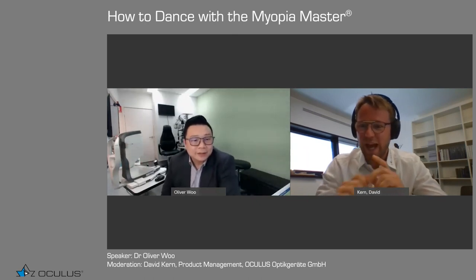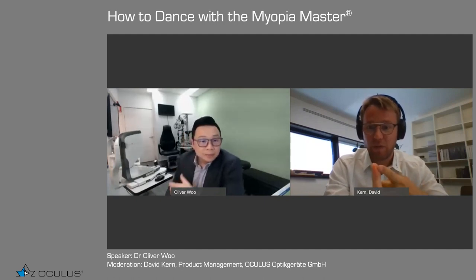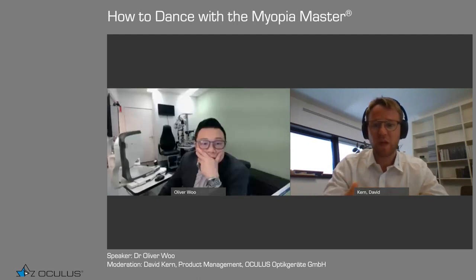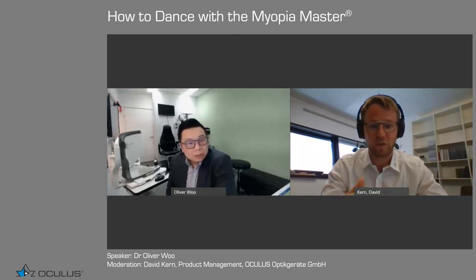Okay, cool. I still have two questions I want to ask you. There are multiple questions popping in here. So the first one is a bunch of three questions altogether. First of all, how long does it take to capture an axial length measurement? Maybe you can say that in a few sentences or a few words. How does it compare with other biometers? And the Myopia Master is a unique device, which combines auto refraction and axial length. Do you also use the auto refraction data or just the axial length?